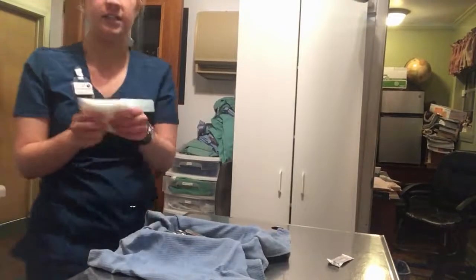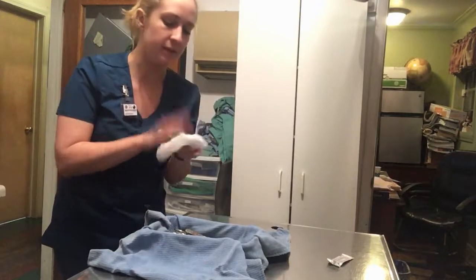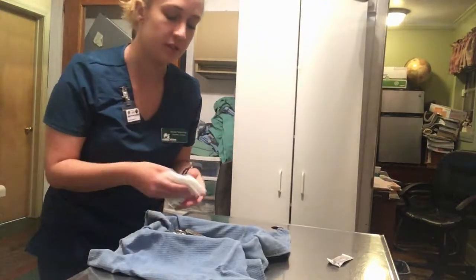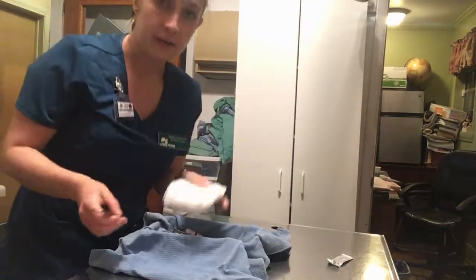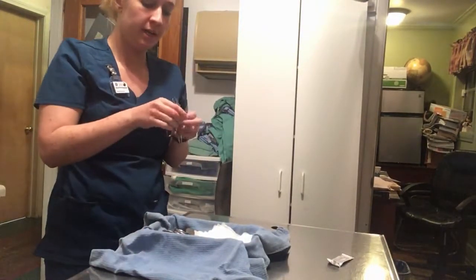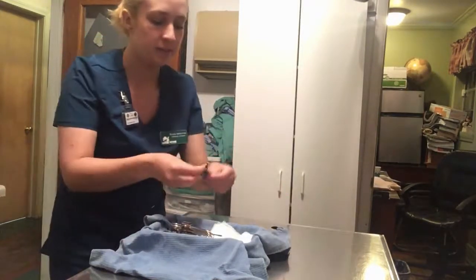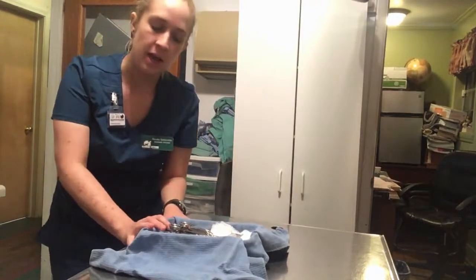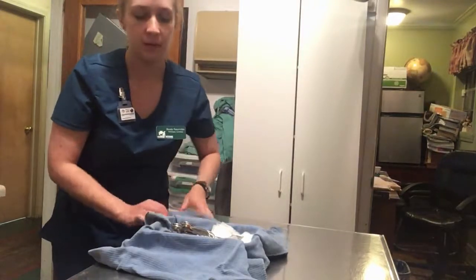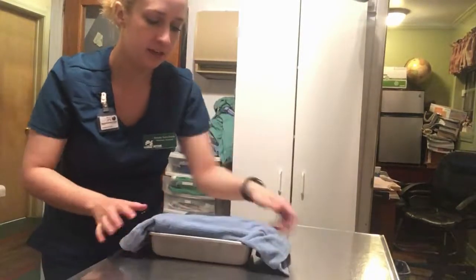And then you're going to go ahead and take your gauze. I've already counted my gauze to 10. That way we know how much is in our pack, in case for some reason the doctor does misplace one. I'm going to put my gauze here on top. And I like to put my towel clamps and scalpel blade on top of the gauze, along with the scalpel handle, because that's what we're going to be grabbing first in order to set up the drapes and set up the procedure. So I'm going to go ahead and get everything folded in.